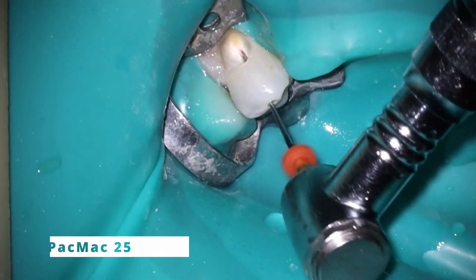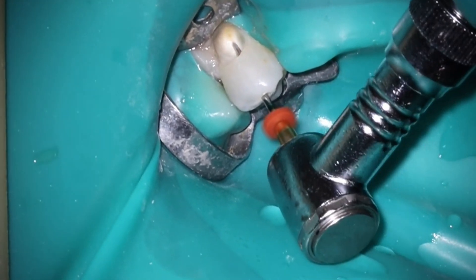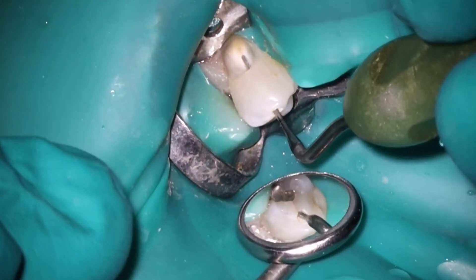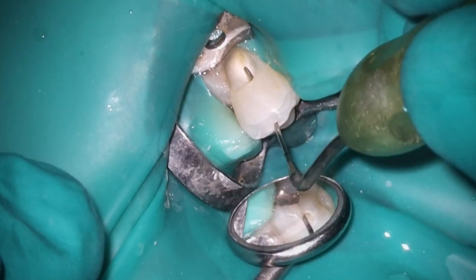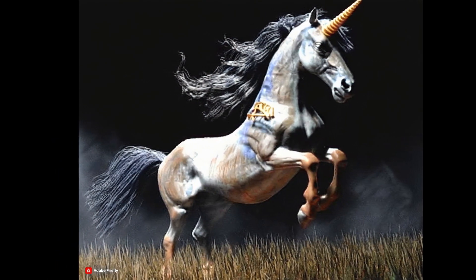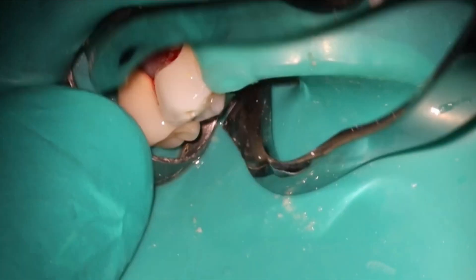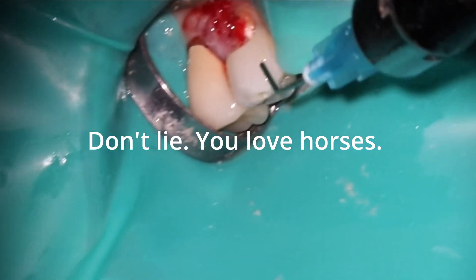Once you start to get used to using the PacMac, one of the cool things you can do is, based on how you brush and push it in and out of the tooth, you can actually remove gutta-percha with it as well. In this case I was able to create the post space using the PacMac, getting condensation of the gutta-percha as well as creating nice space. I'd also like to introduce a new post here — our unicorn, or as my team calls it, the Unicorn. This is what AI thought a unicorn would look like — pretty stinking metal. I didn't want this channel to become a horse channel but somehow it has, and I appreciate all of you for coming along with my insanity.